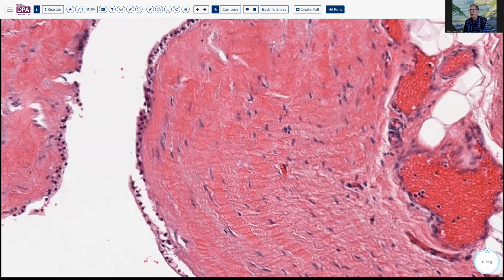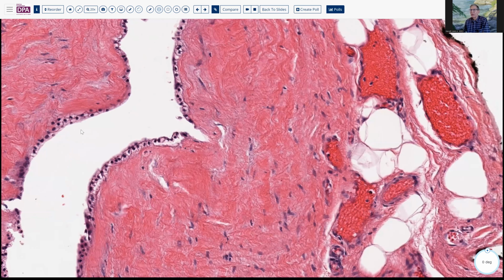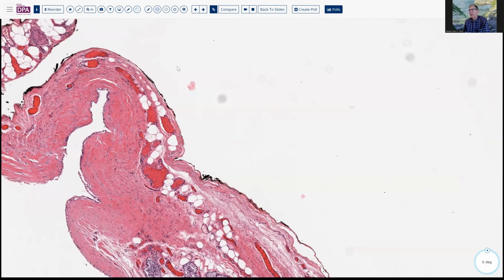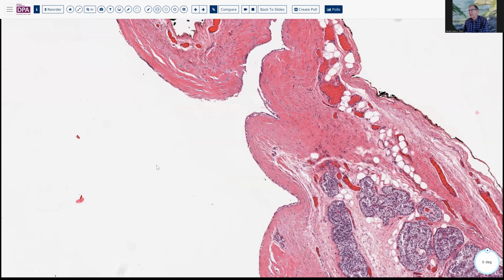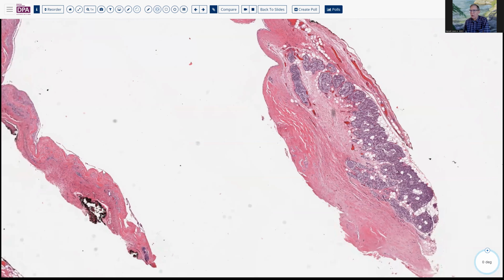Now, these might be indistinguishable from any other cuboidal epithelium, but were you to do immunohistochemical stains, you would discover that these will stain with markers that similarly mark the parathyroid. The importance of this is that on rare occasions, this cystic lesion may become clinically evident and may be sampled either by a fine needle aspiration or, as you see in this case, surgically.